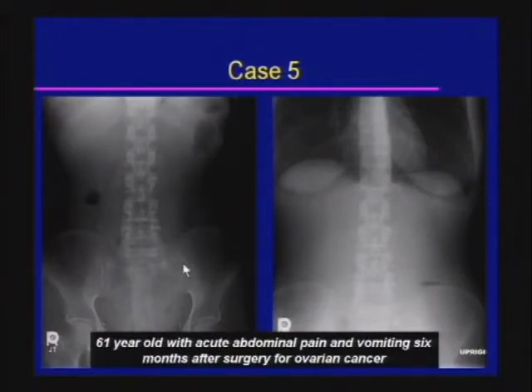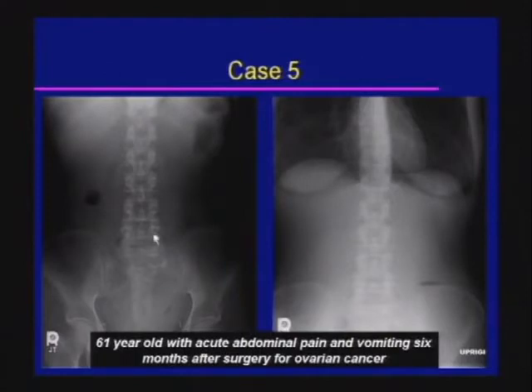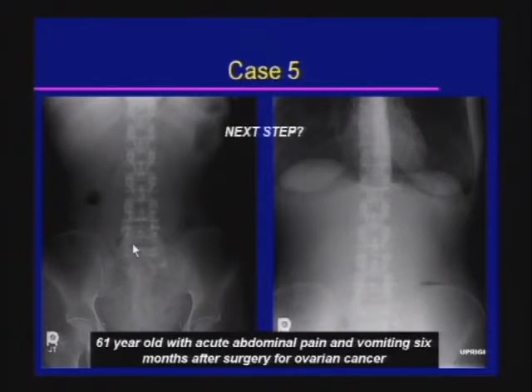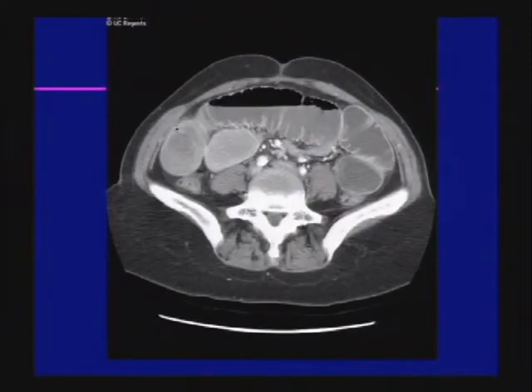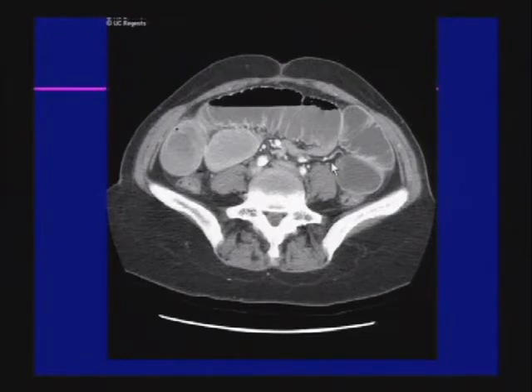Case five: a 61-year-old with acute abdominal pain and vomiting. The abdominal x-ray shows a gasless abdomen with no free air — demonstrating how futile x-rays are in this setting. CT shows multiple dilated loops of small bowel with a sharp transition between dilated and non-dilated segments. Evaluate the transition area for masses, hernias, or intussusception. If none are found, it is most likely adhesive small bowel obstruction.